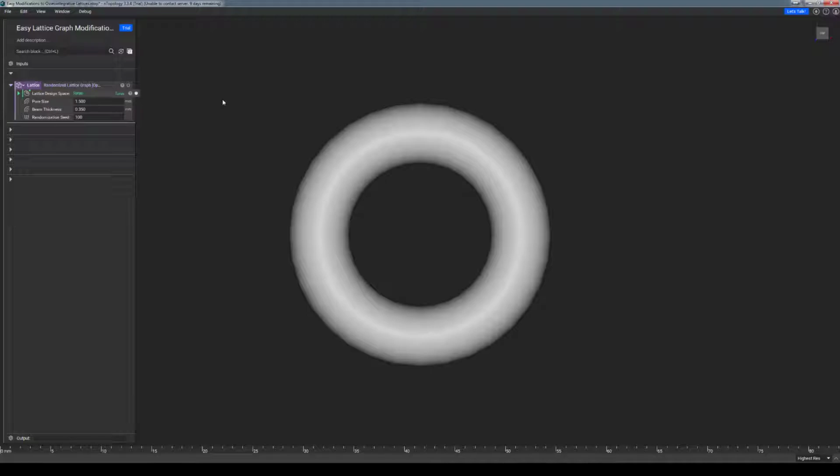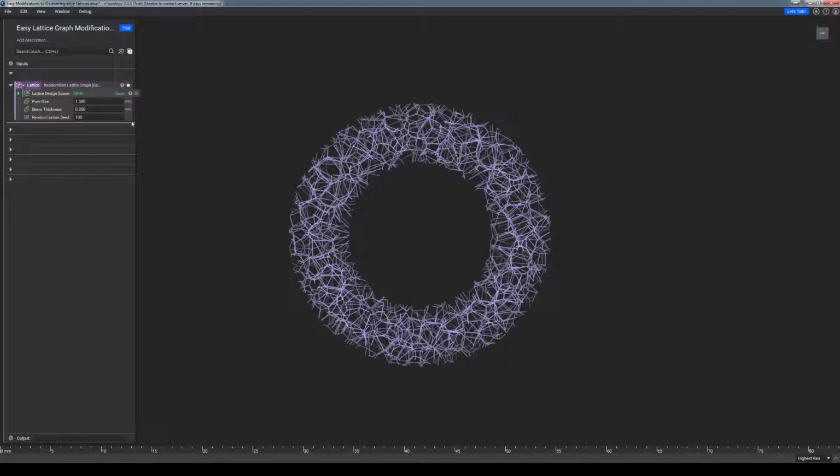Alright, so what I have here is a really generic donut shape that I filled with a randomized lattice using one of the blocks in the osseointegrative structures toolkit. Using this, I'm able to call out a target pore size, a beam thickness, and a randomization seed value to keep this lattice unique. What is also built into this workflow are considerations for different types of geometries that you may want to populate with a lattice, as well as the boundary conditions around the edges that keep things uniform from center of geometry to the fringe end. If you are interested in knowing more about how this specific block works, feel free to open it up and take a peek inside.